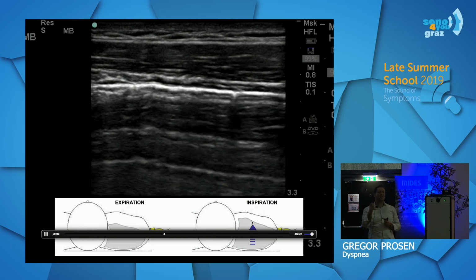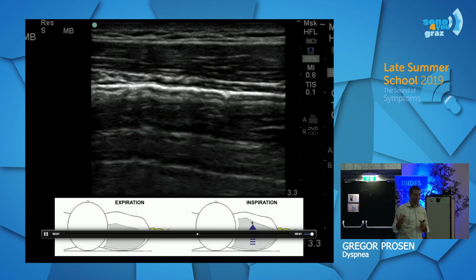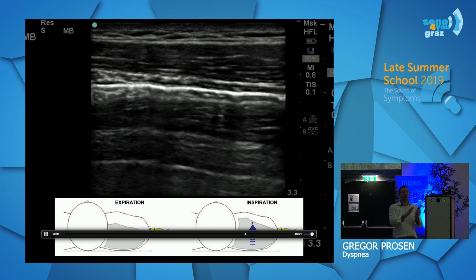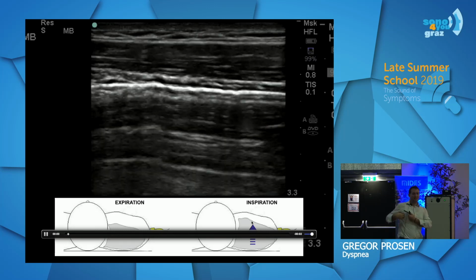No. That's why sensitivity of lung point is low, but this pneumothorax will be very big, probably tension pneumothorax. So in such a big pneumothorax, we will not see lung sliding, but we will also not see lung point, which is specific, but the patient will be dyspneic, and most probably we will hear less breath sounds on the right side.